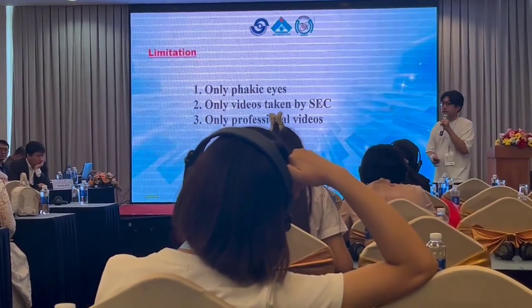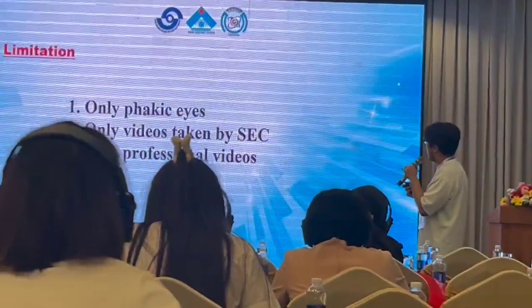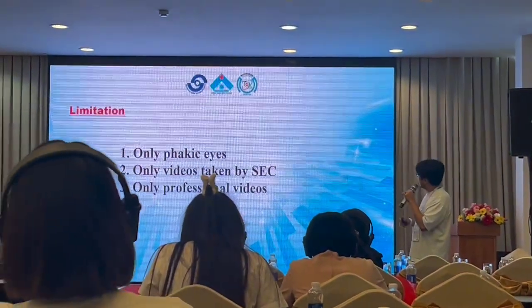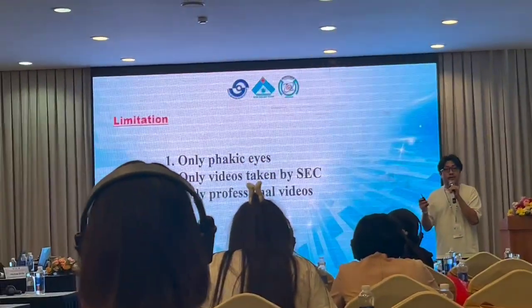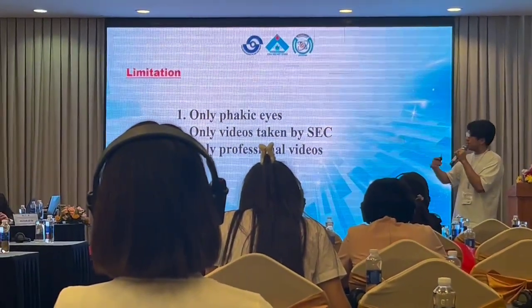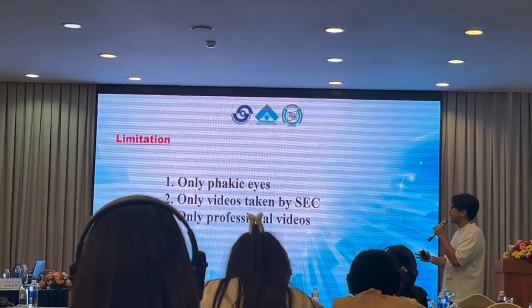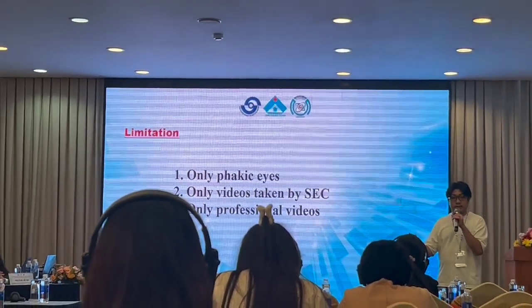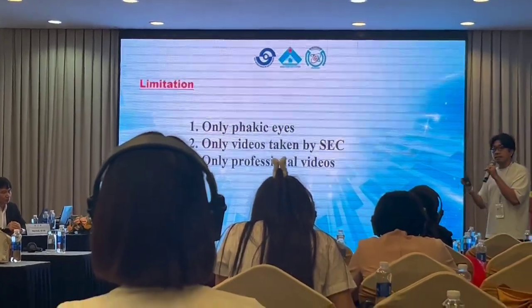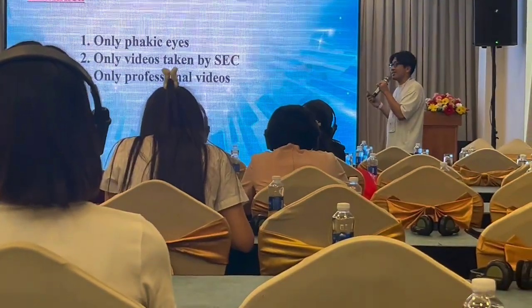For the limitations of the study, first, the eyes are only phakic and all not dilated. The second is that the video was only taken by SEC, so we need to do further validation using normal slit lamp photos. And the third is that the video was only taken by professionals, that is, ophthalmologists. So we want to do further studies with non-ophthalmologists, such as optometrists and nurses, taking the video, and validate the data.